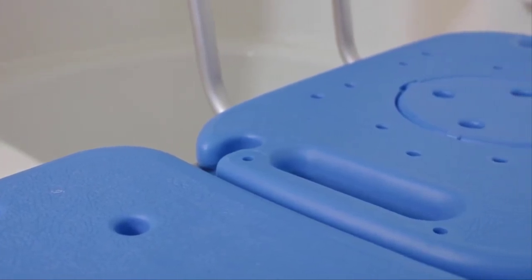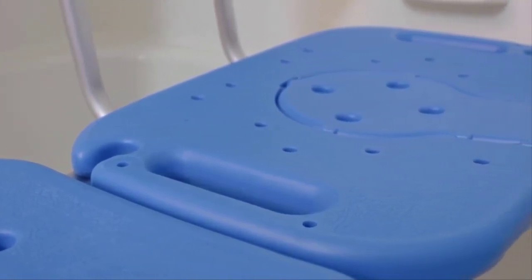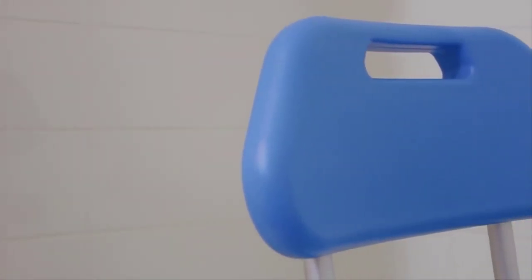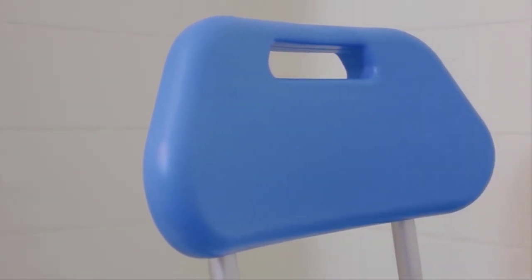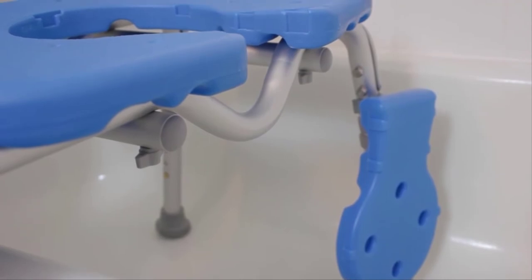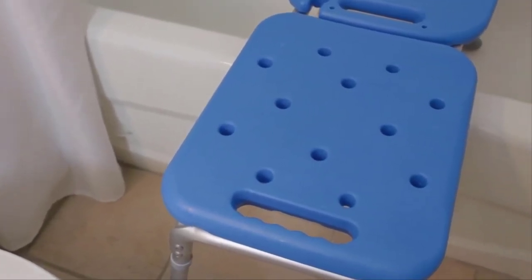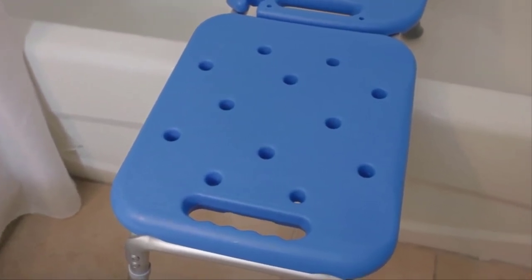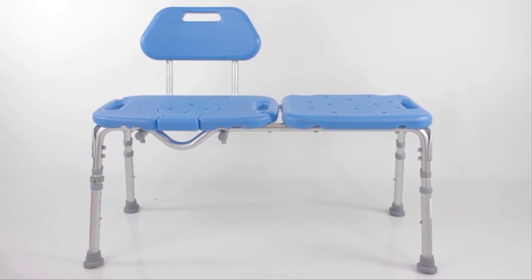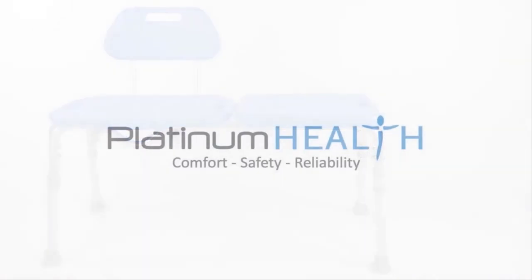The All Access's exclusive high-view blue color helps visually and cognitively impaired users more easily distinguish the chair from its surroundings to help prevent slips, trips and falls. The blue components also eliminate staining and discoloration issues commonly associated with old-style white or gray benches. The All Access is the perfect companion for anyone that wants a safe, comfortable, dignified and easy-to-use bath transfer solution.